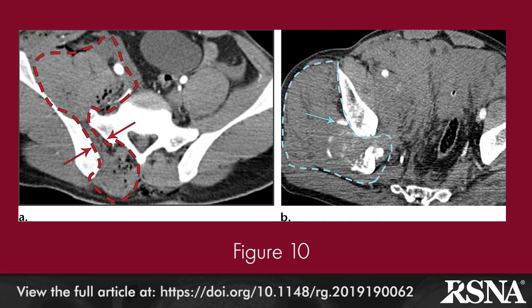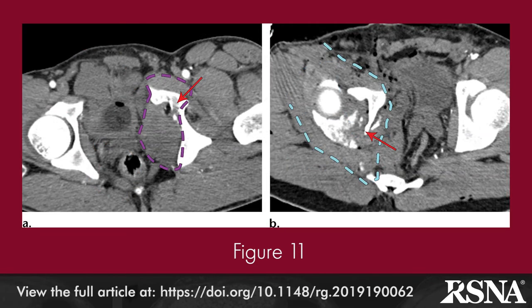Acetabular fractures injure the obturator and inferior gluteal arteries. Figure 11a shows an axial CT image in a 45-year-old man at the level of the acetabulum demonstrating an obturator artery injury, a left acetabular fracture, and a territorial hematoma in the obturator internus muscle. Figure 11b shows obturator and inferior gluteal arterial combination injuries, right acetabular fractures, and territorial hematomas around the obturator internus, gluteal muscle, right hip joint, and greater sciatic foramen.